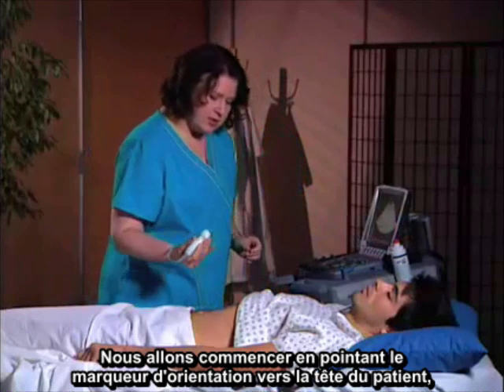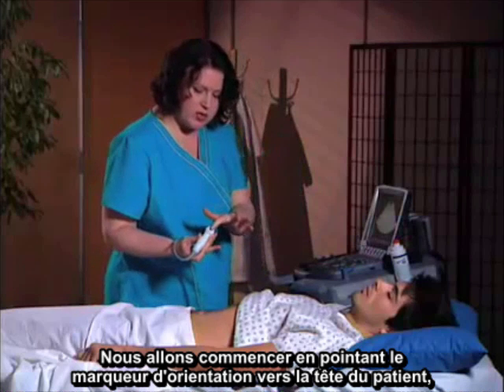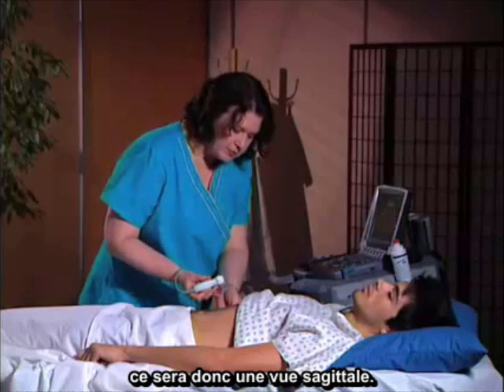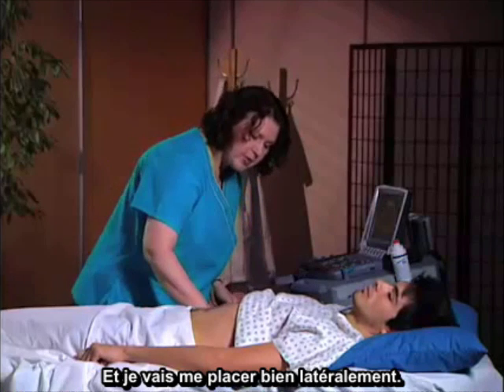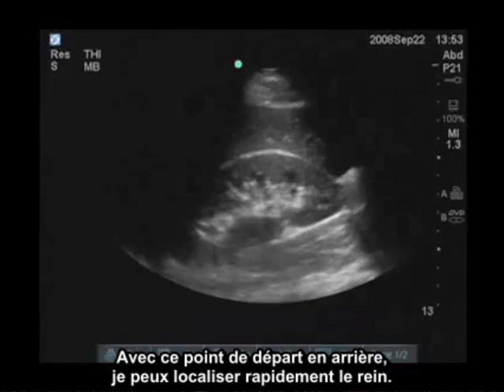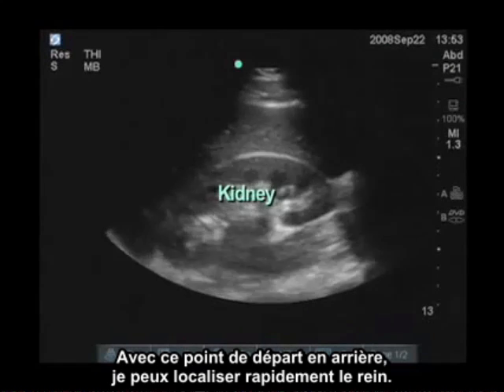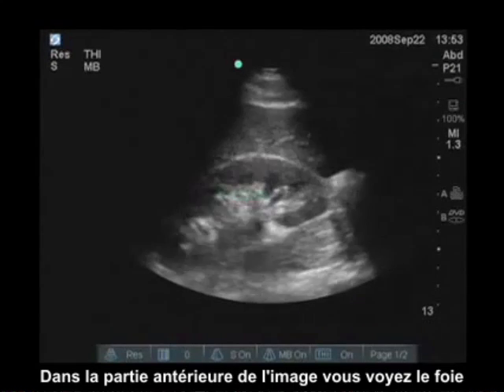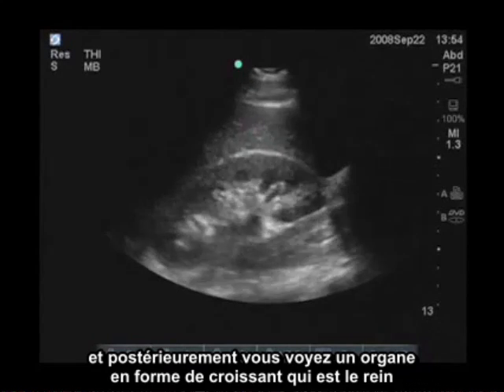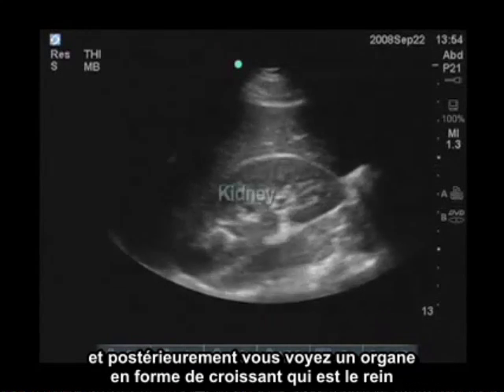We are going to go in with the orientation marker pointing to the patient's head. So this will be a sagittal view. And I'm going to go in fairly laterally. With this starting point, I can quickly identify where the kidney is. In the anterior aspect of the image, you see the liver, and immediately posterior to that, you see a crescent-shaped organ, which is the kidney.